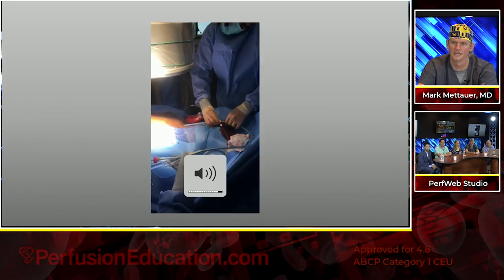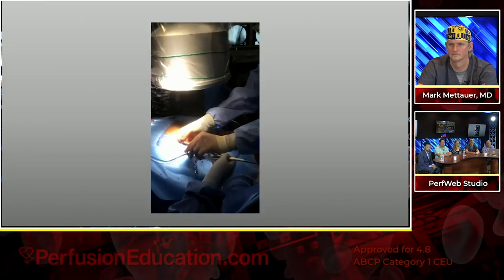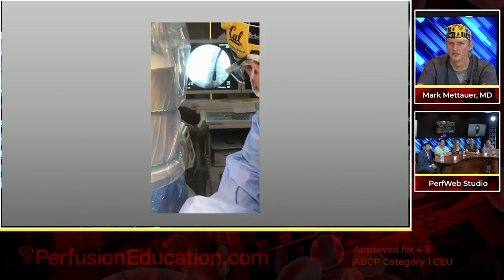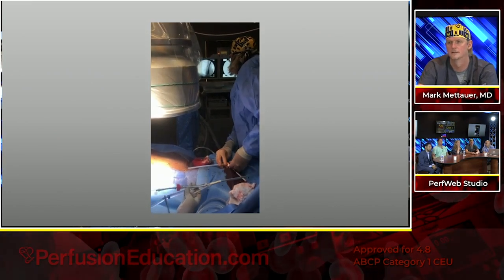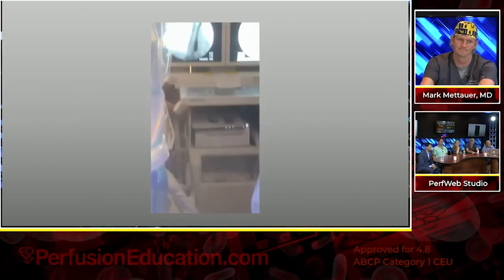So the femoral line's already in. That's the easy part. You're going to feel another dip when it goes out through the lower thoracic. Hold on a second, that wire. Live. Kicked into the RV. And you actually don't even have to have that wire in there, just as long as you have the dilator. I did that today because I didn't want the wire into the heart. And that sheath's so big, once you watch it go in, you can start withdrawing the dilator as you're pushing it in. About that second give?